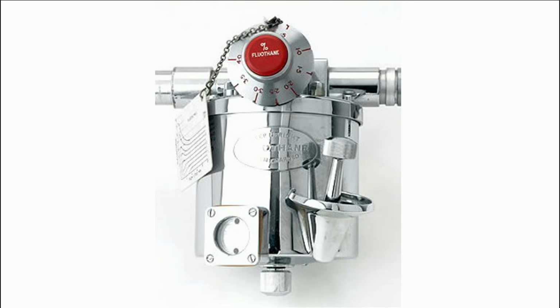What you're looking at here is an early Cyprane Fluotec vaporizer from the late 1950s. This was one of the first commercially successful precision plenum vaporizers and marks the beginning of the lineage that will ultimately lead to today's TEC vapor systems, and of course, the electronically controlled vaporizers that you probably use in the operating room. Before devices like this, delivering volatile agents was far less predictable.